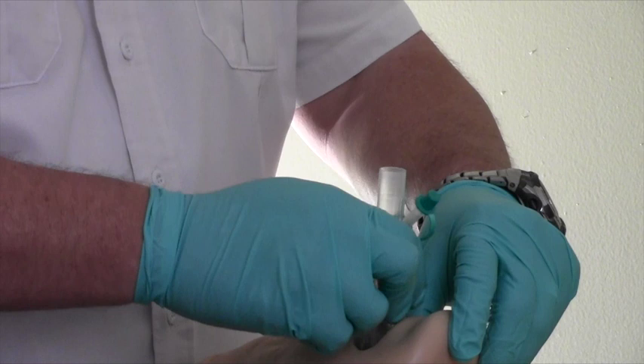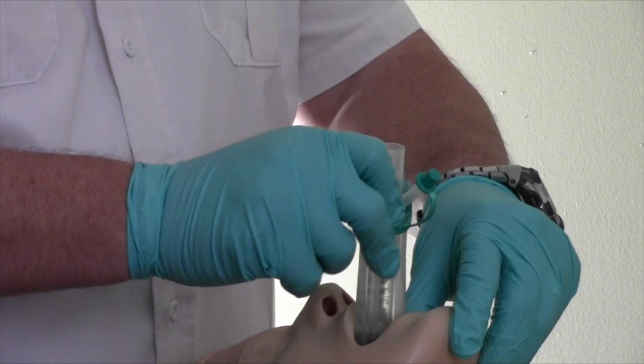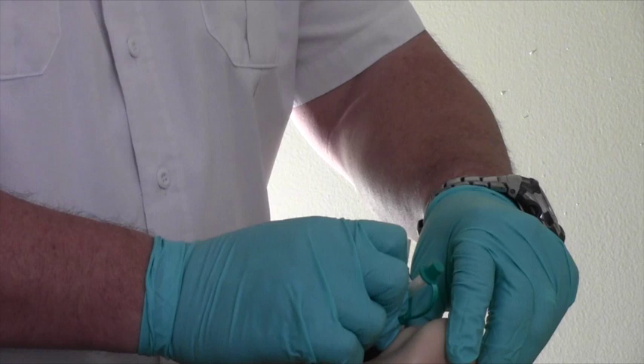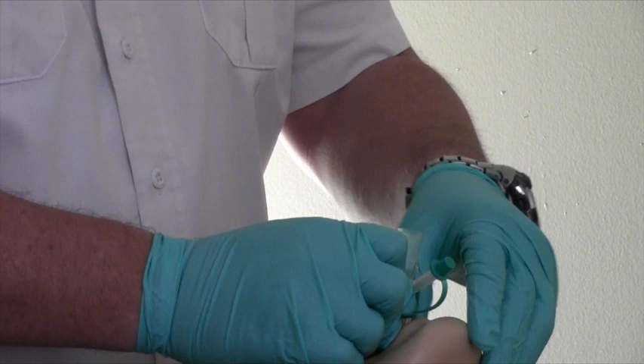At this point, the tip of the airway should be located into the upper esophageal opening and the cuff should be located against the laryngeal framework. The incisor should be resting on the bite block area of the tube. At this point, you may begin to ventilate the patient. Notice that the elbow connector is being used.